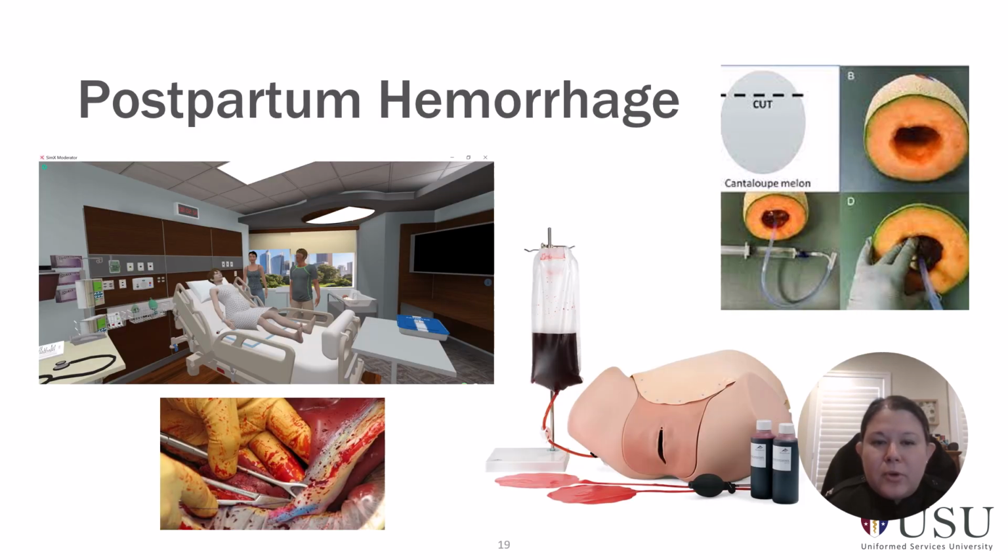And then for postpartum hemorrhage, a wide range of options for postpartum hemorrhage simulation, including virtual reality, some task trainers shown here with fake blood. The operative experience trainer also has a model that just does postpartum hemorrhage. So then you can practice clamping things off, doing things like the B Lynch suture, and then some low fidelity options for training. The upper right is a publication we did a couple years back looking at training for the Bakri balloon and for postpartum hemorrhage simulators.